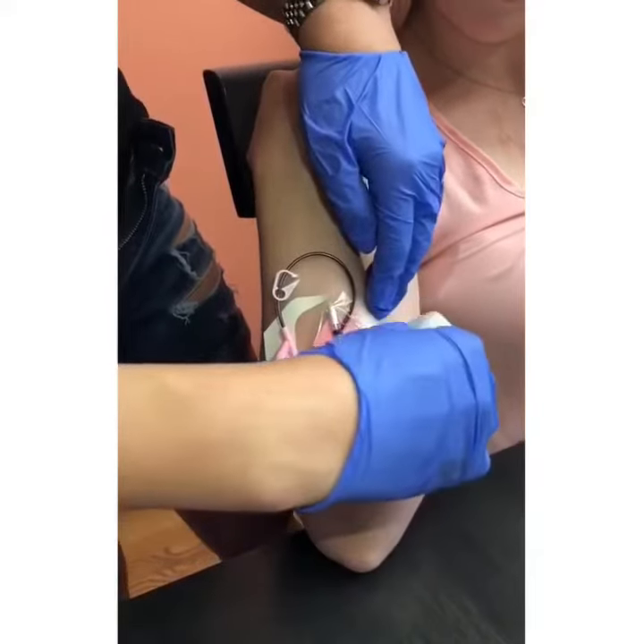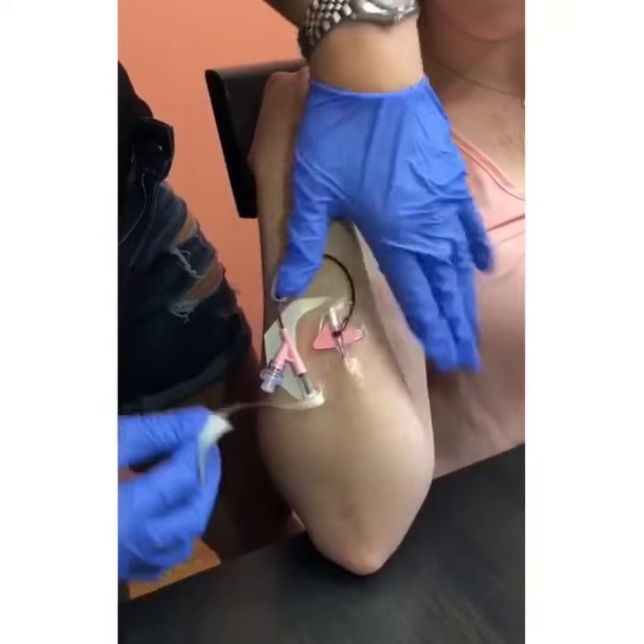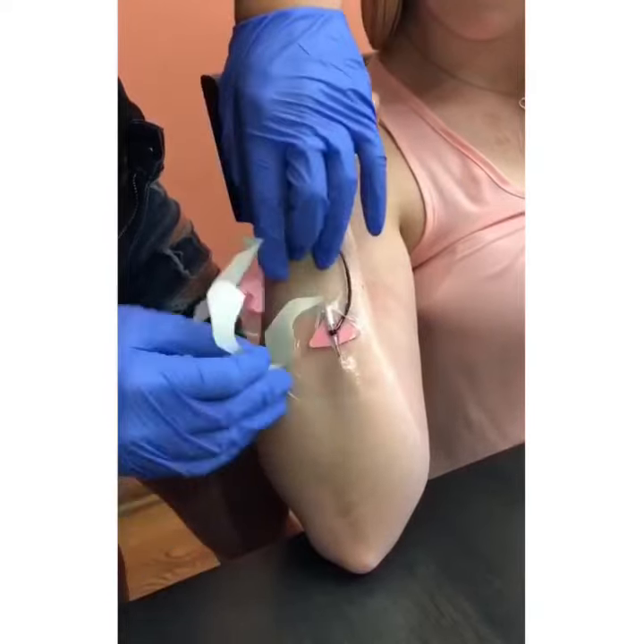The skin on this part of the arm is thicker than the skin of the inner forearm, so it is less painful for patients as well.